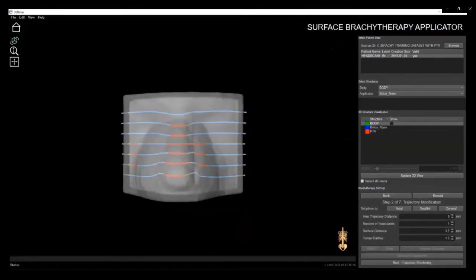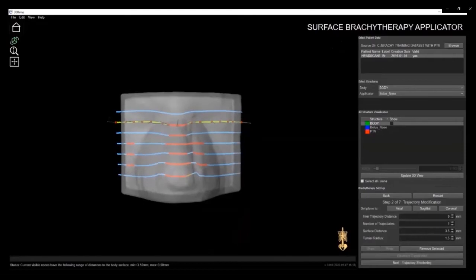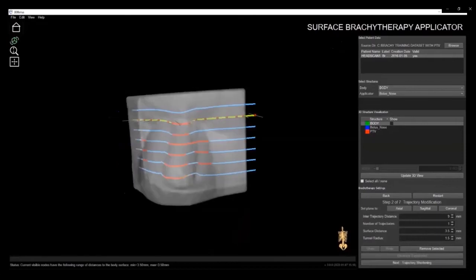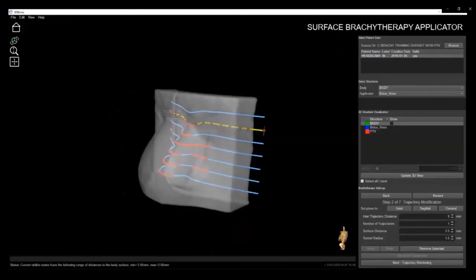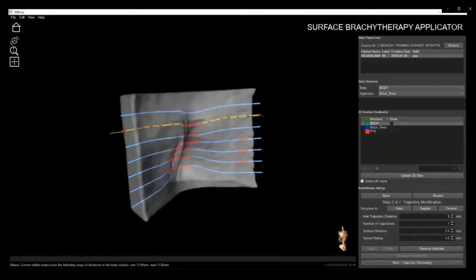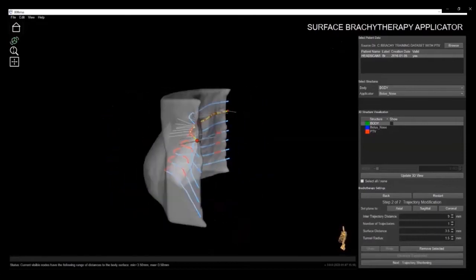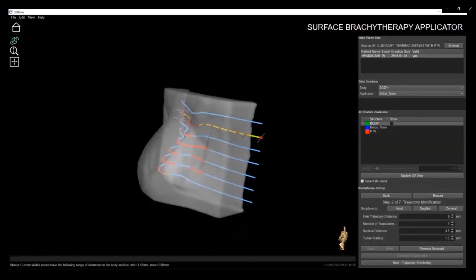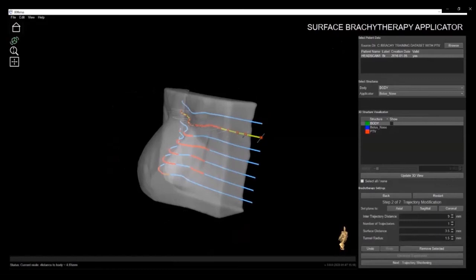In the first step, we will generate trajectories. You may notice that certain portions of the trajectories appear as red lines. This occurs when our algorithm detects that the radius of a curvature may be too steep and can result in a catheter or source becoming stuck. You can manually fix these areas of concern by clicking on the nodes and slightly adjusting them to smooth out and correct any problem areas.